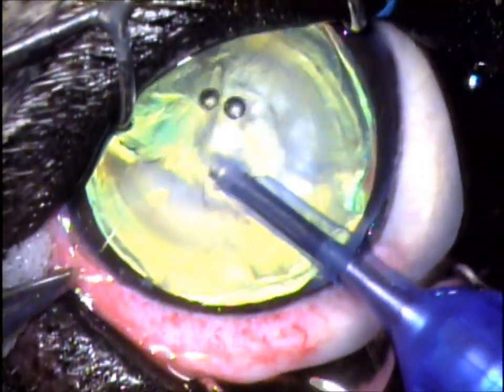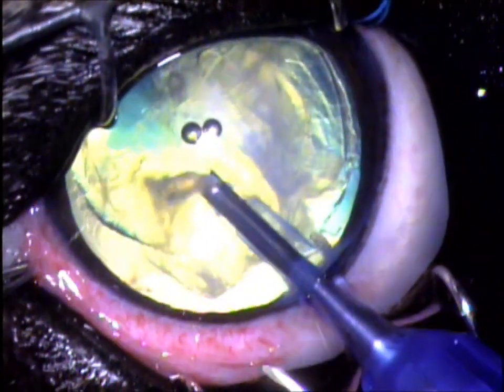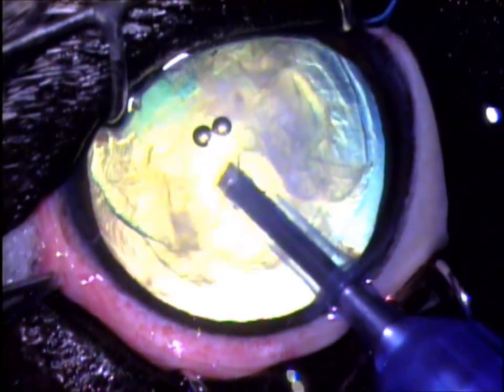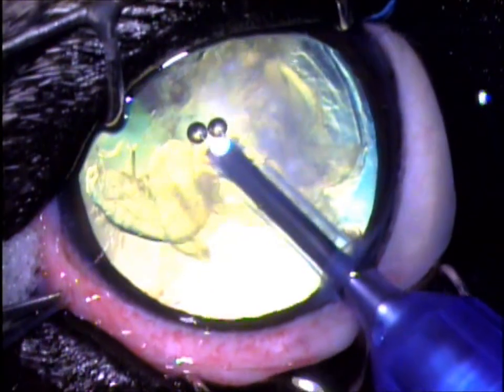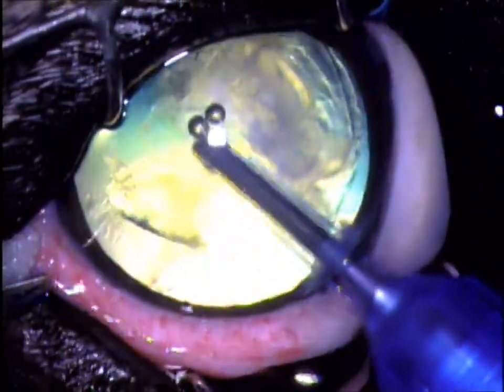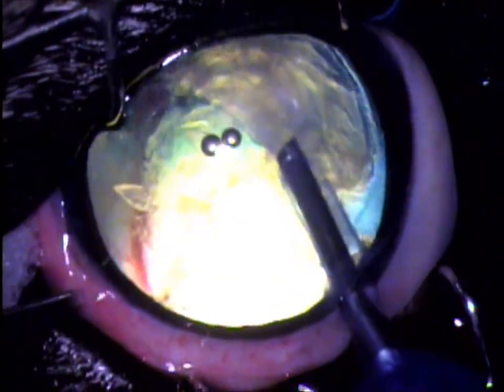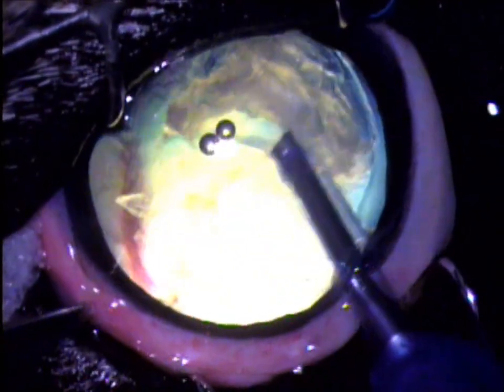Here comes some of the lens nucleus. The rest of it's breaking up, and as this happens you can start to see the tapetal reflection, which is that green eye shine at the back of the eye. You're seeing the retina now, behind the lens, deep at the bottom of the eye. And there on the left is a blood vessel, if you look close. The remainder of the lens is coming out.